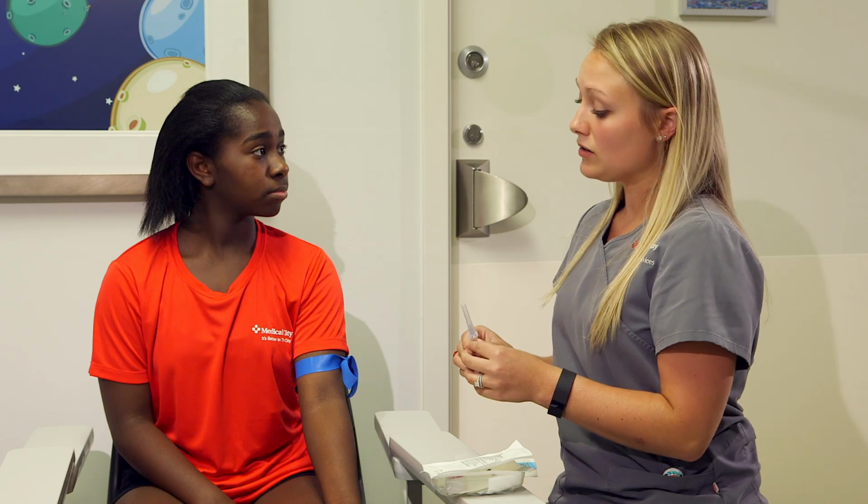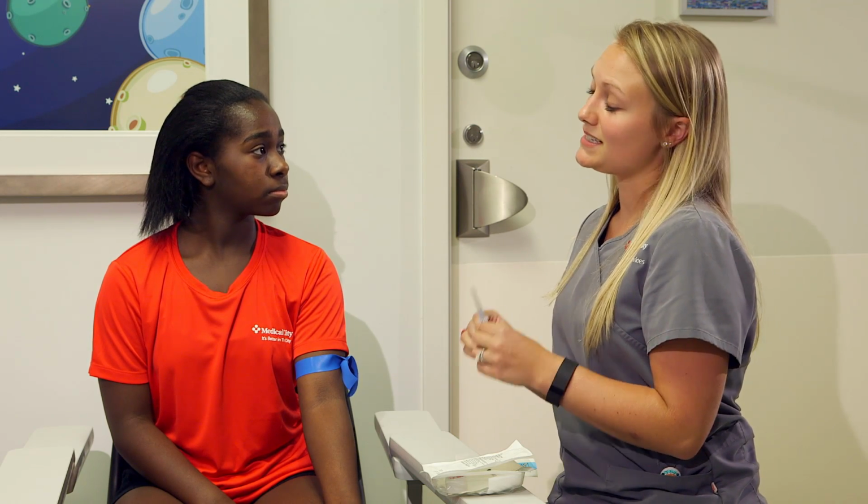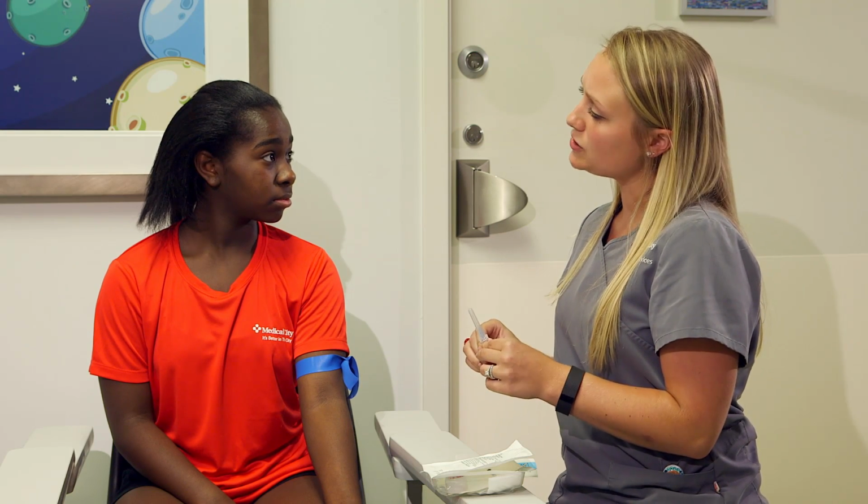I will take the needle out and throw it away, but the straw will stay in to give you your medicine. Your job is to stay as still as a statue. Does it hurt? Some kids say it feels like a pinch, but I'll let you tell me what you think. You can watch or you can look away. That wasn't too bad. It helped to take deep breaths and blow out some air. Once you have your IV, it's time to go to the MRI room.